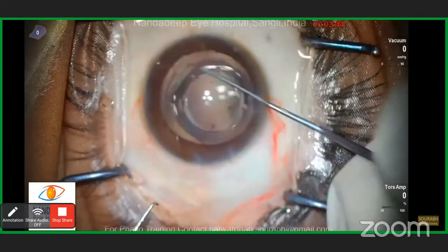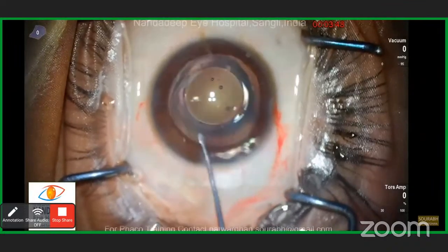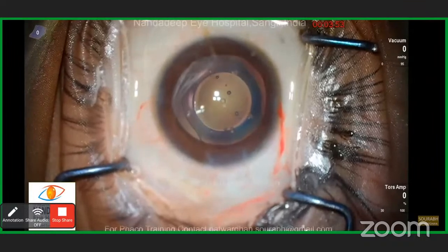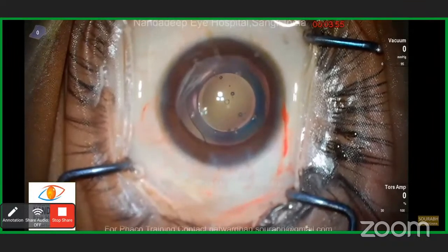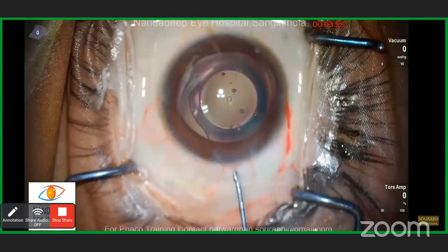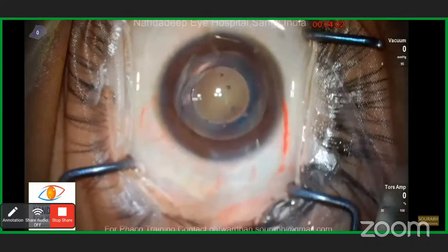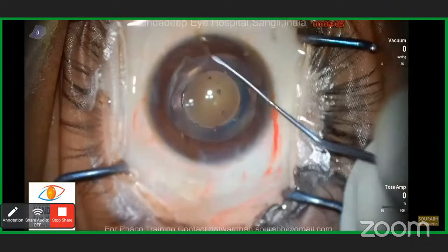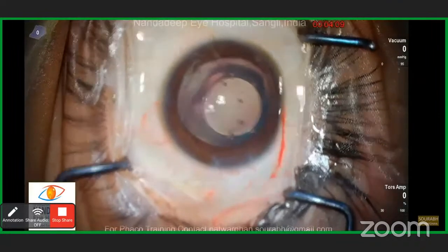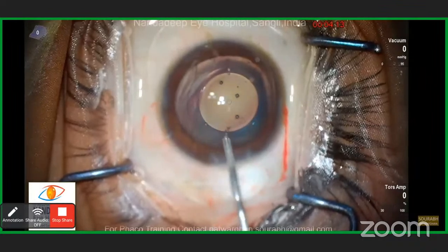If the patient cannot see clearly with the specs, then with IPCL also they will not be able to see clearly. So in those cases, scleral contact lenses are better, or we may have to do some corneal procedure, like topo-guided PRK or something like that, or Intacs maybe.